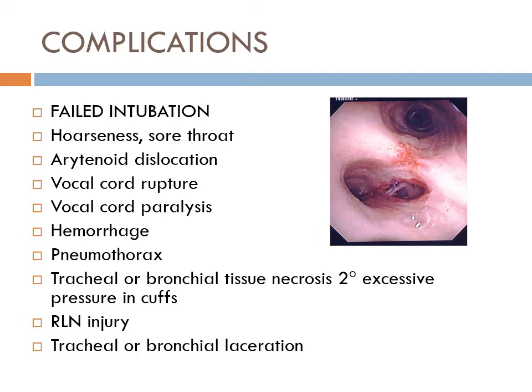What you see here is most likely, first of all, so you look at these pictures, and you need to definitely be able to guess where we are on the test. There's definitely hot spots when it comes to that. The hardest thing people struggle with is where do you clamp on the tube to ventilate, which is going to cause which side of the lung to rise, and so on. But we're going to get into that.